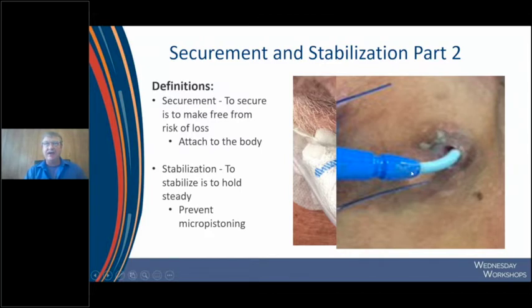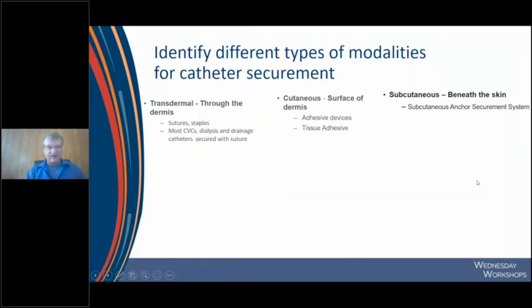And you notice the flexion of this catheter. It's pushing on this side, and the skin is really building up on the right-hand side of this insertion site, where it's really gapped right here. So we've got a big giant gaping hole, with pus pockets coming out. This can't be good whatsoever.